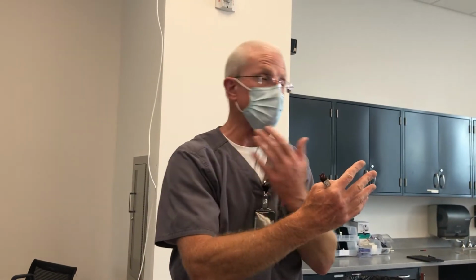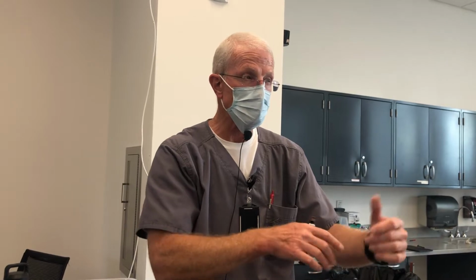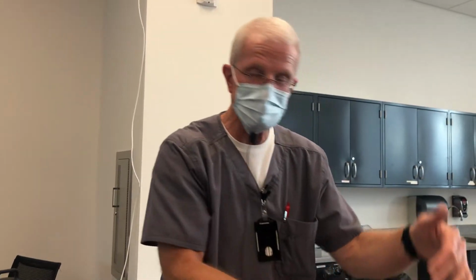Back to the aesthetic resin cements. If you're doing veneers, for instance, base only, that's all you want. You want light cure only, because you can get light everywhere, okay? If it's a ceramic onlay in the back part of the mouth, you want to add the catalyst to it so it's dual cure in nature. Does that make sense? Because the light may not get into some of the far recesses of those preparations in the back of the mouth.